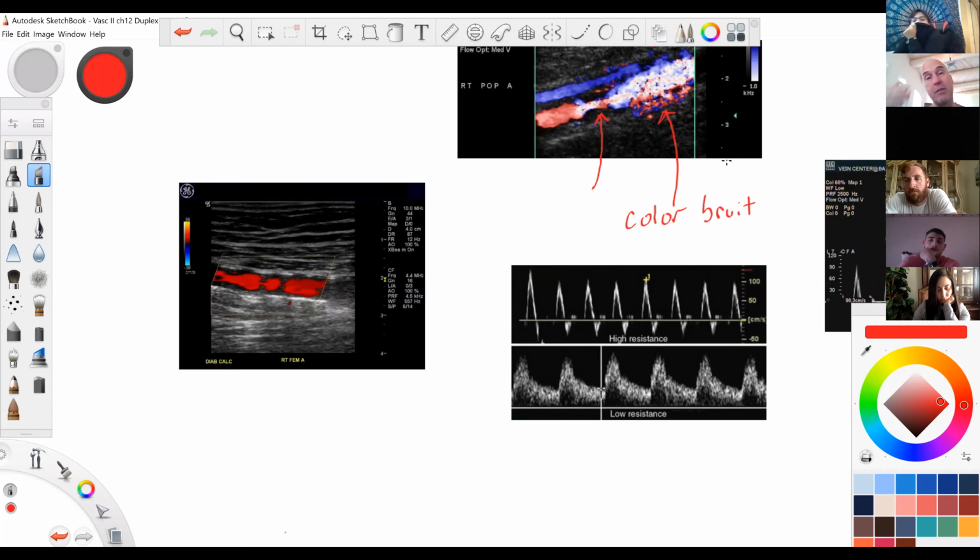Well, it's not the blood pressure that's high, it's the calcifications in the wall. You can't even close that wall because it's literally like a rock. And that happens all the time, and it happens mostly in diabetic patients.